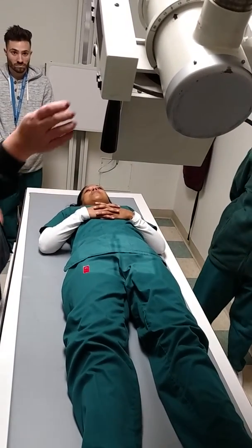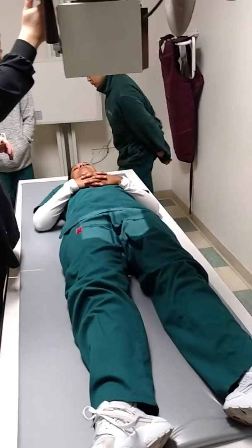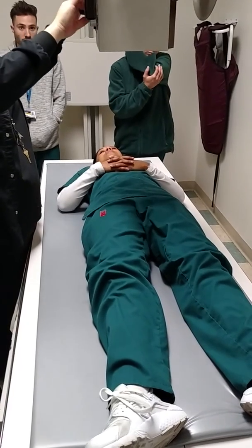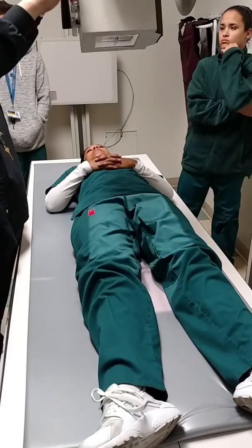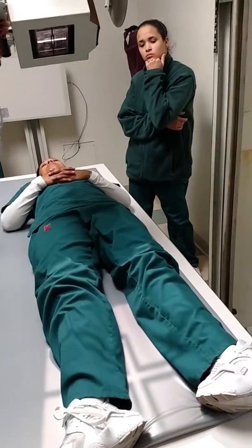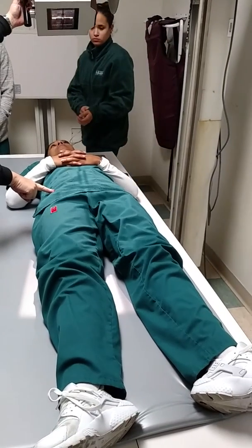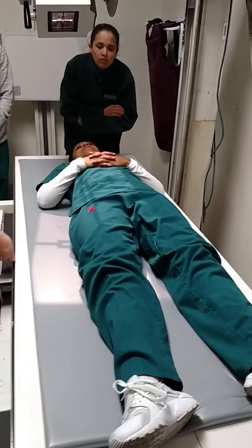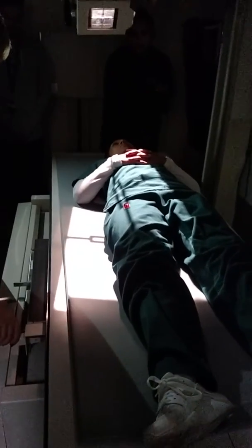Now we need an inlet, and that's the same for everybody, for men and women. And it is a big light field. So it's a 14 by 17 portrait. And see how it's 14 by 17, but when I angle 40 degrees, look how big my light gets. It's ginormous. And the central ray is right on ASIS. The other one is 1 to 2 inches below pubis. This one is on ASIS.